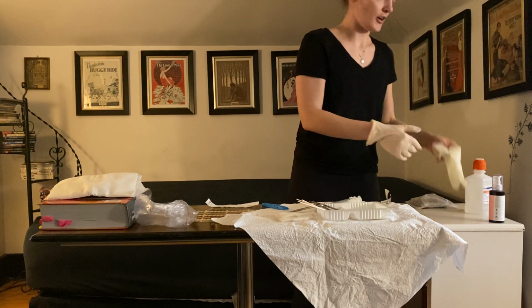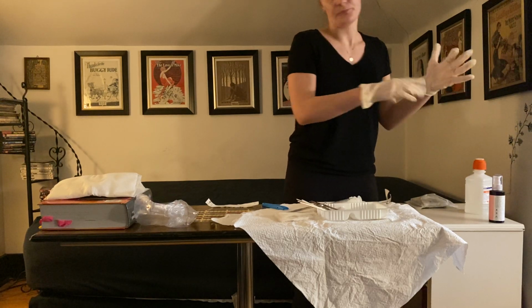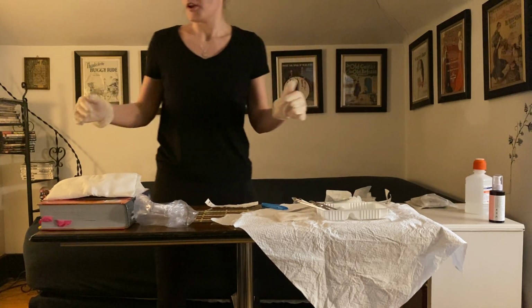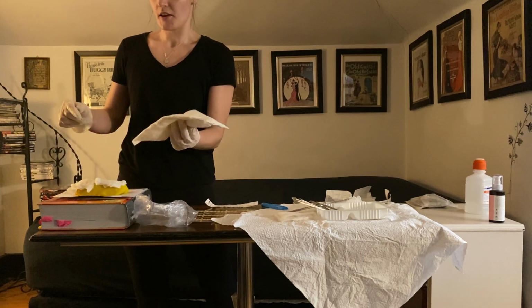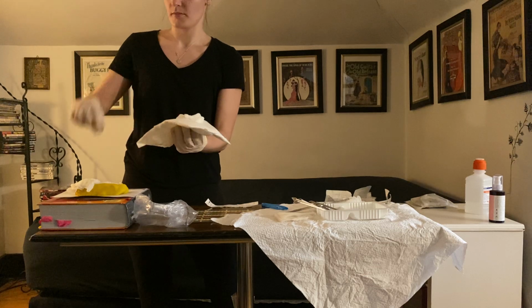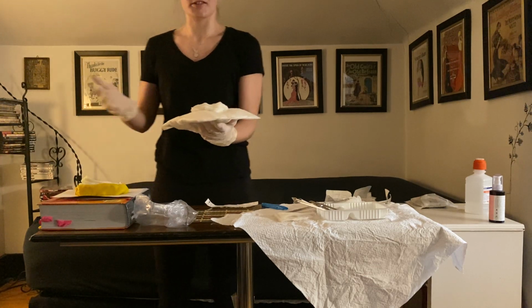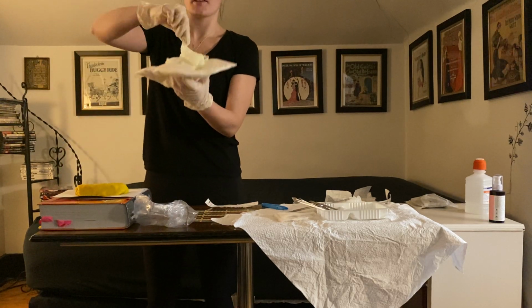And I want to note the amount, color, and any odors that are coming off from the old dressing. So noting the color of the drainage on the old dressing, and then the amount, so like percentage. So you could say it's sanguinous or serosanguinous. Putting that there and then disposing of that.